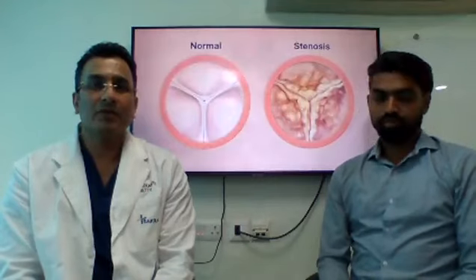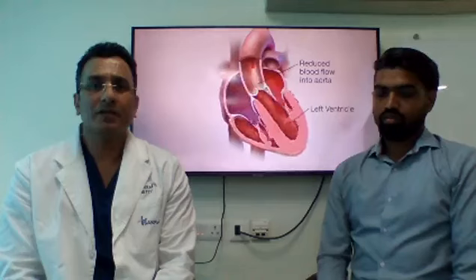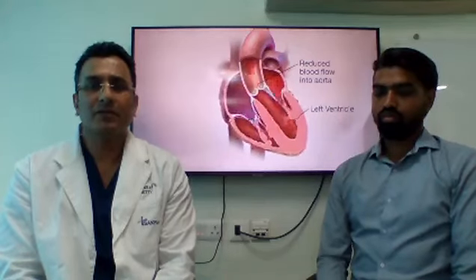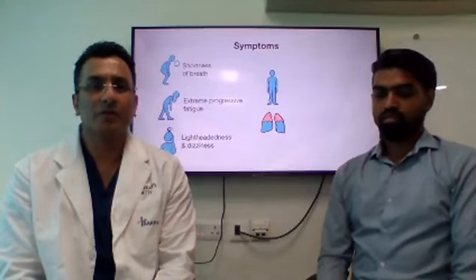So how long will a TAVI procedure take? A typical TAVI procedure can be done under IV sedation and local anesthesia. Rarely you need general anesthesia for the procedure, and it takes about 1 to 1.5 hours to perform the procedure.